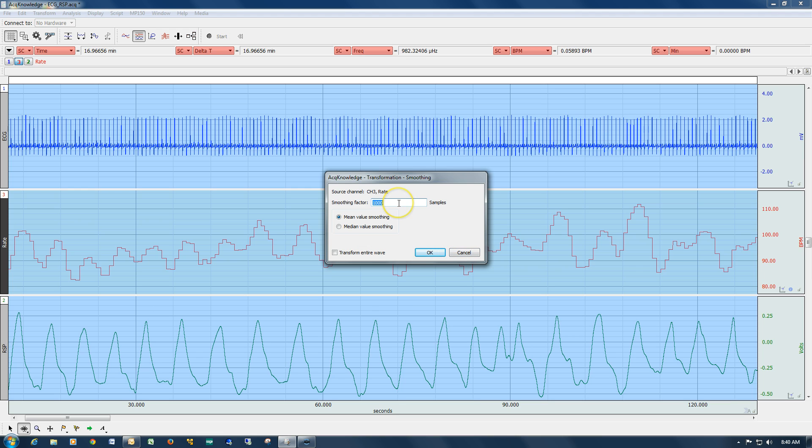The greater the number of samples you use for your smoothing, the more aggressive the smoothing will be.